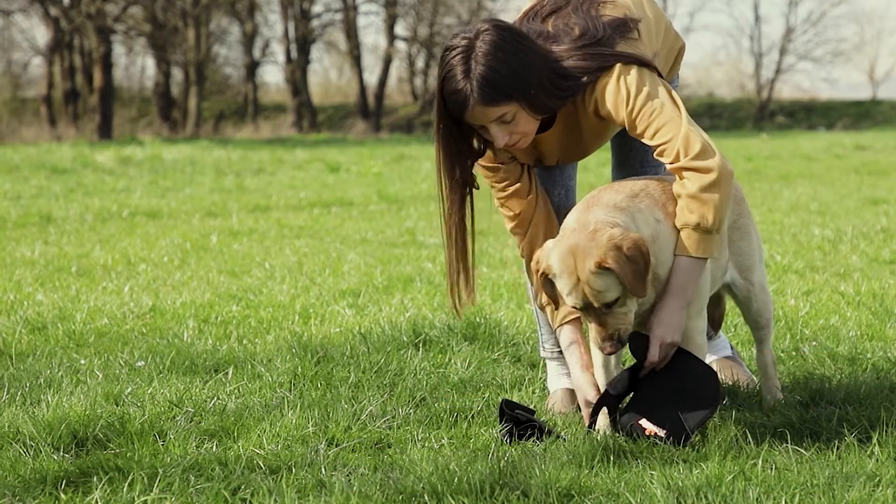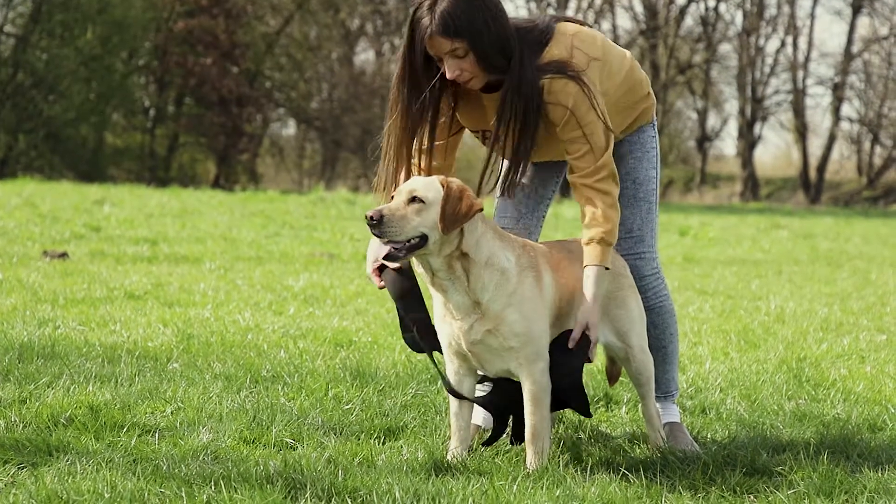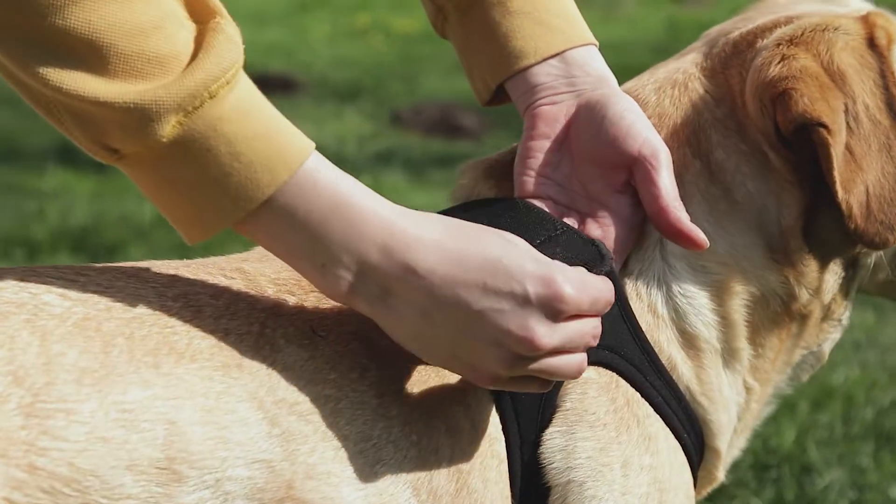With your dog standing, slide the brace underneath. Lift and put the unaffected leg through the opening. Wrap the strap around her back, then push it through the buckle and snap the Velcro.